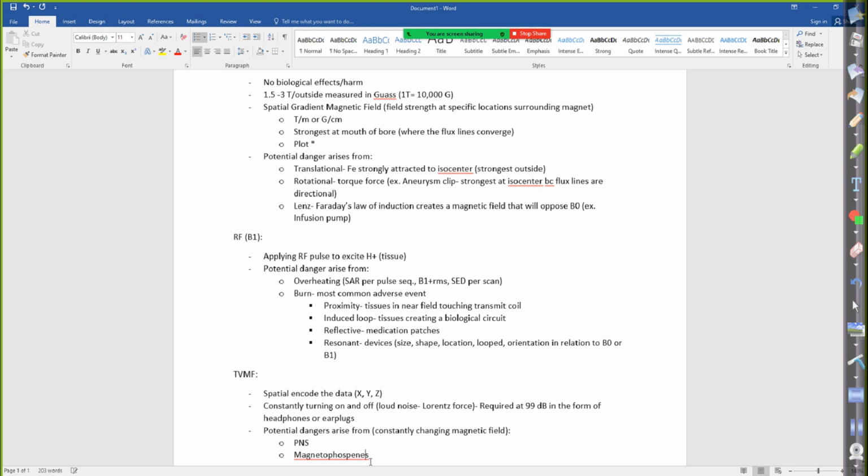All right. And then peripheral nerve stimulation. Not a concern, but one of the videos hit on something: until it really starts to be a full organ stimulation, and that can happen. If we think about the heart and how the SA node fires, that's very electrical.